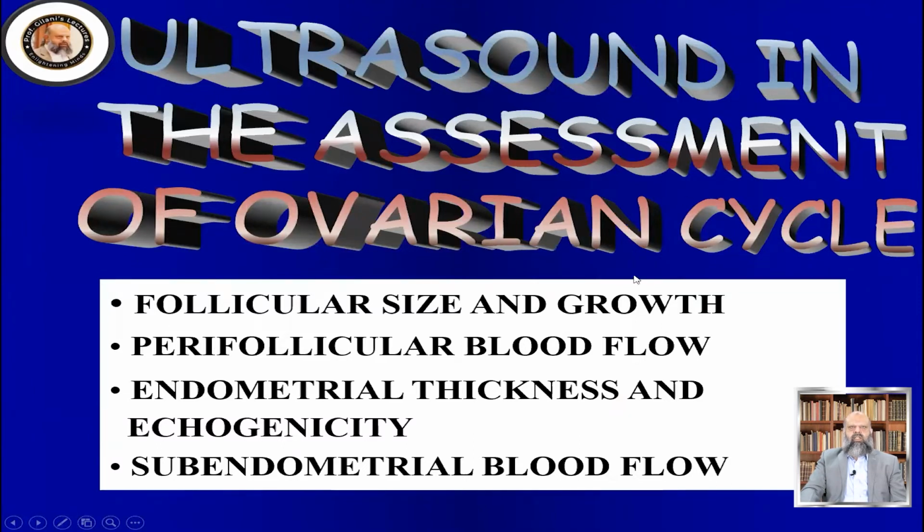Ultrasound in the assessment of the ovarian cycle is very important. The follicle size and growth is assessed. Then the perifollicular blood flow, endometrial thickness and echogenicity, and then we look at the subendometrial blood flow.